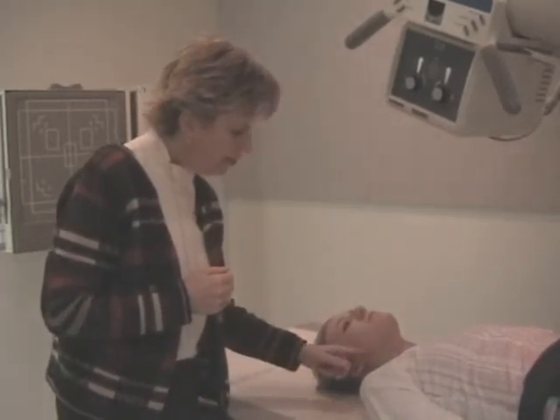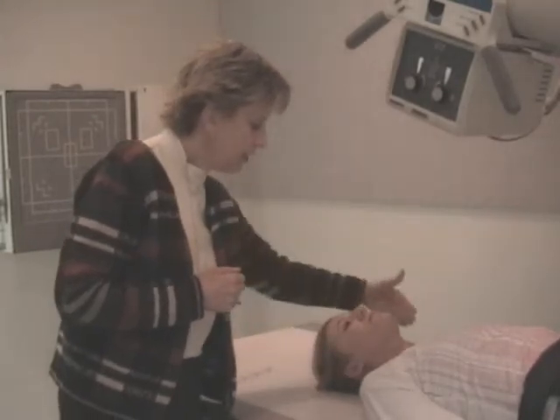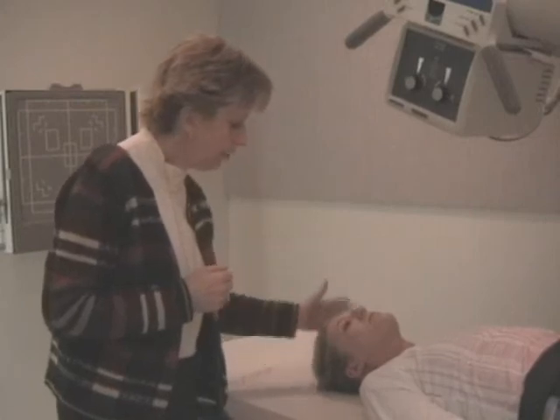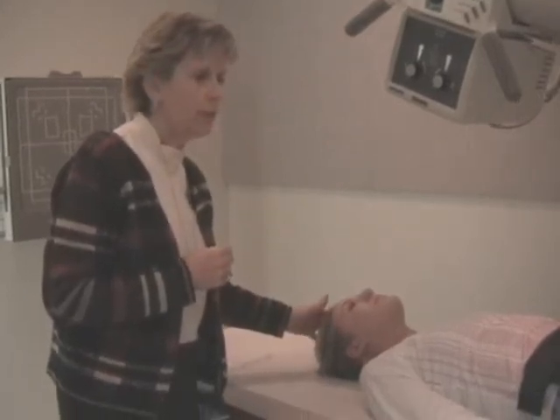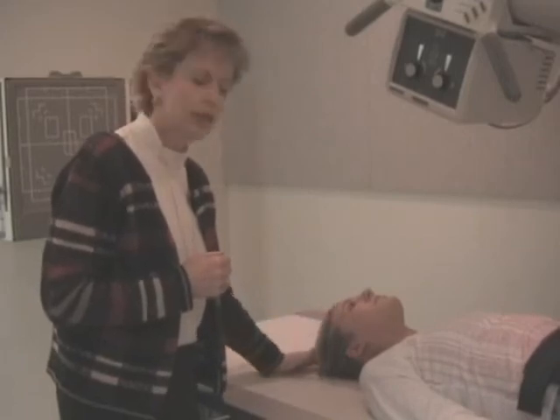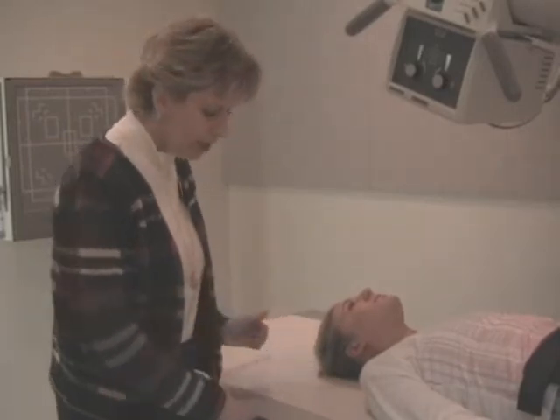But the space here, the mandible will be further away from the spine on this side as compared to that side. And that would be evidence that you took the projection in a rotated position. This would be your AP. And we have one last projection to do.